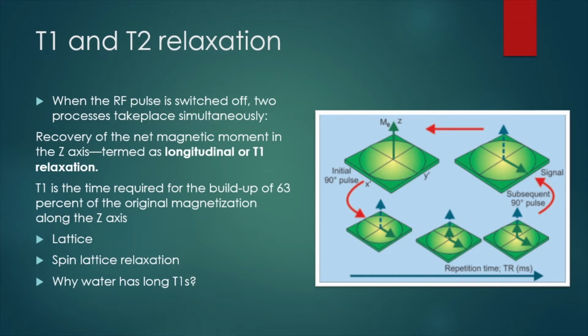So when you say an external magnetic field, it's the magnetic field in the bore of the magnet. You consider your body as having numerous protons, and you place your body inside the bore of the magnet. Your protons will align parallel or anti-parallel, and then they get nullified.